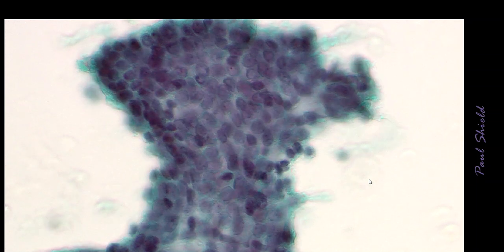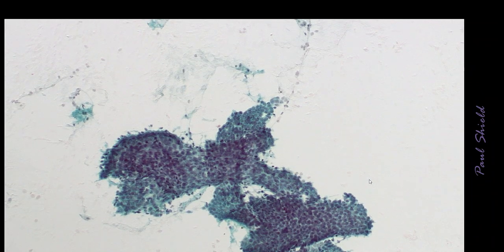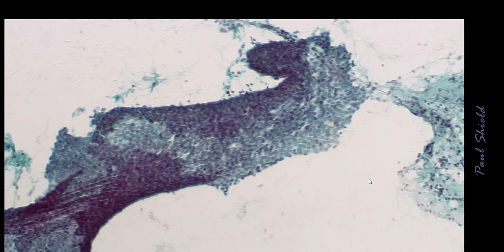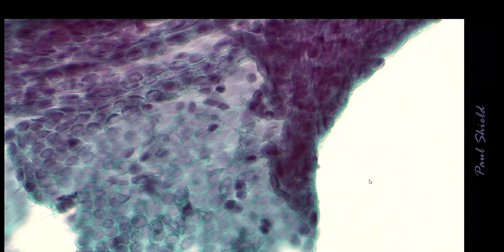On high power, we can see that lovely bimodal pattern with the darker myoepithelial cells lying over the top of the epithelial cells. And when you get your eye in, you can even see that on low power, in these branching, cohesive, rounded groups. Notice in this area here, we've got a lot of bare bipolar nuclei too. These are the myoepithelial cells stripped off the epithelium. Just showing the bimodal pattern in there again. It's quite obvious. Notice you have to focus up off the epithelial cells to see it.